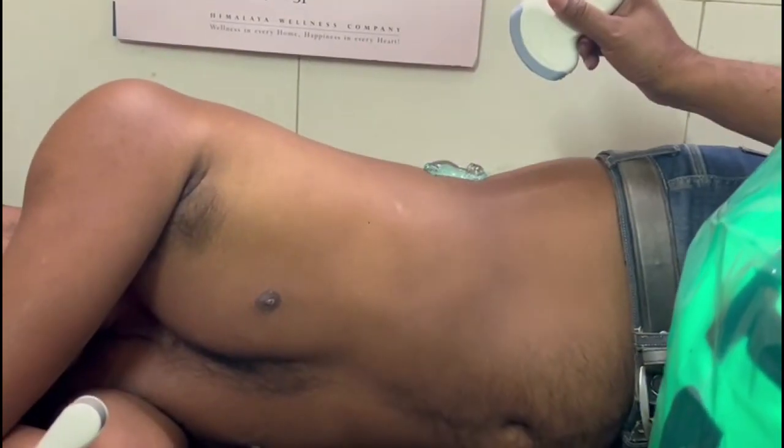Now I am putting my probe, giving jelly over the left kidney. It is the right lateral position, and the left kidney is on the upper side.